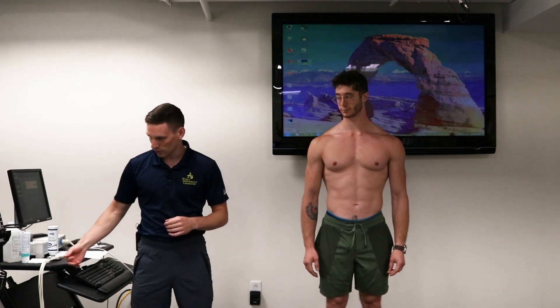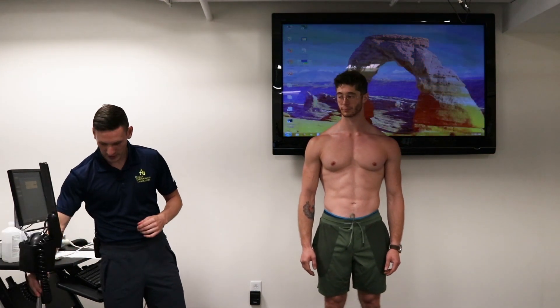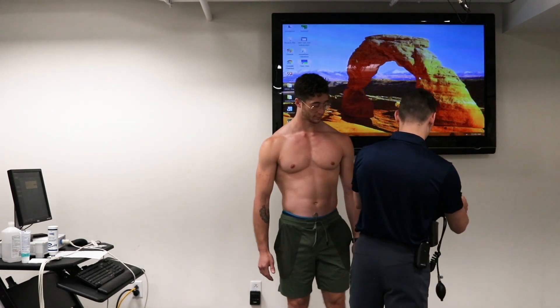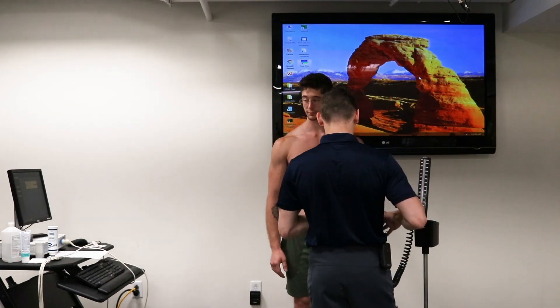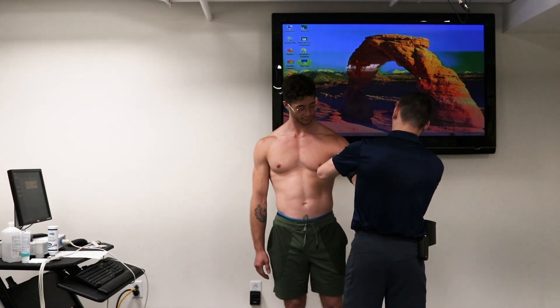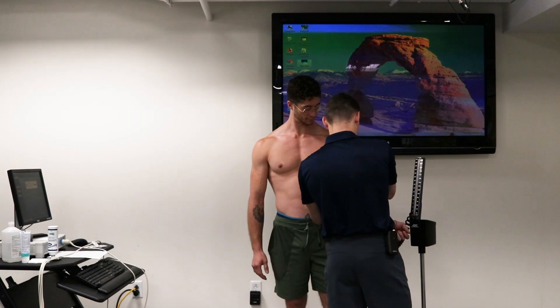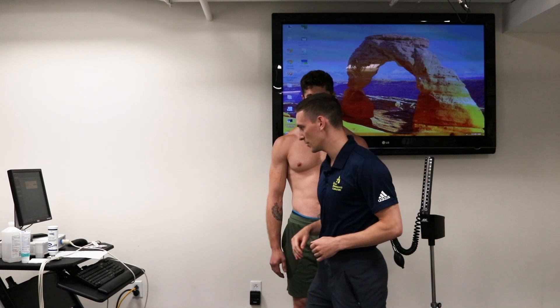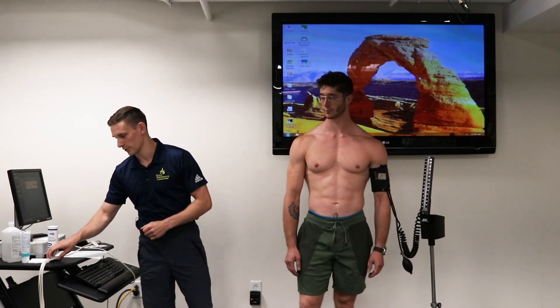Before we get started with anything, we'd like to make sure we've got our BP cuff on. If that starts to slide down a little bit right now, no big deal — we'll fix that later on.